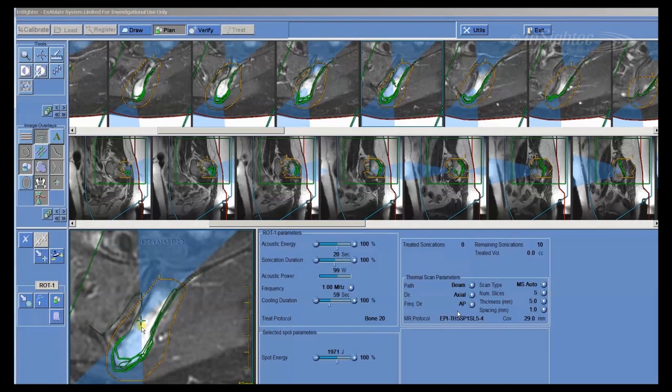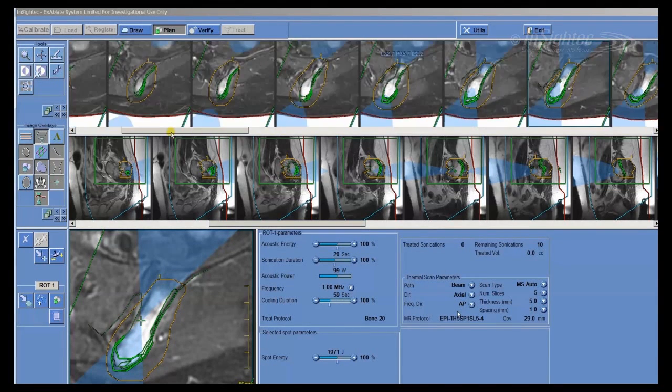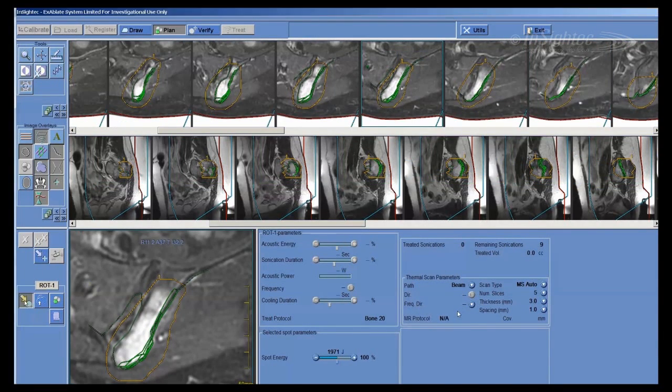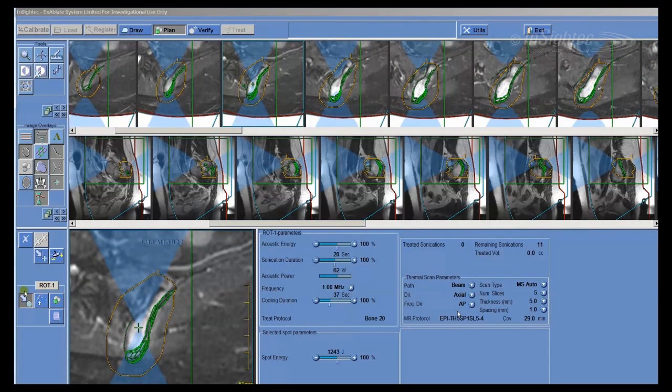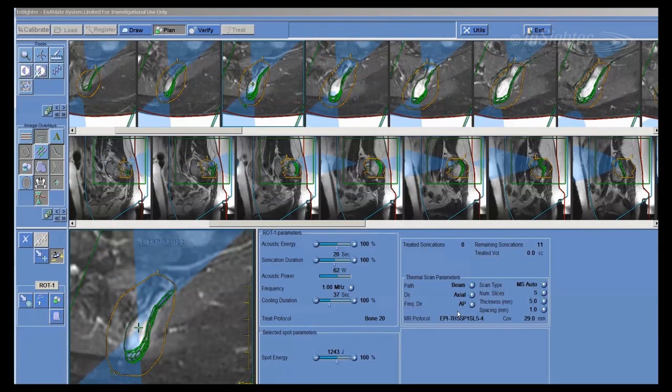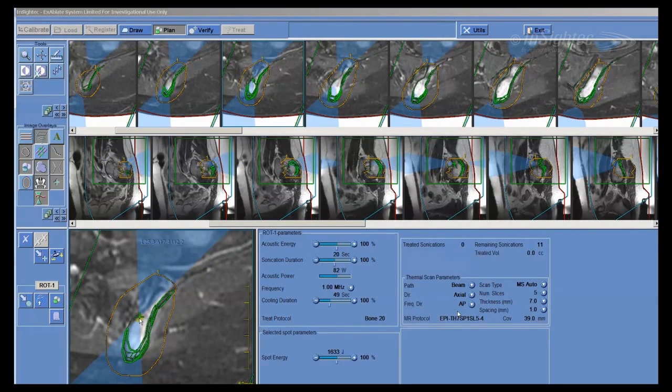Based on this input, the system generates a treatment plan including energy levels, number, and size of spots. At any point, the physician can add spots, delete or move spots, or change the angle, changing the energy to optimize treatment.